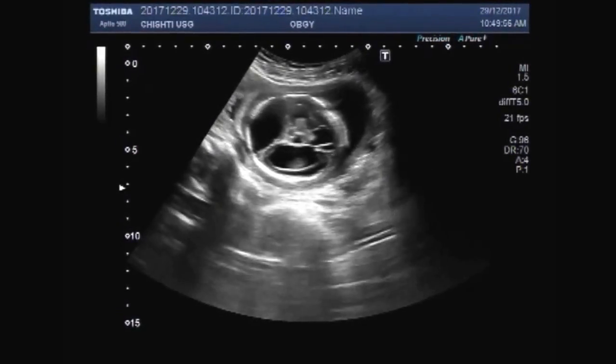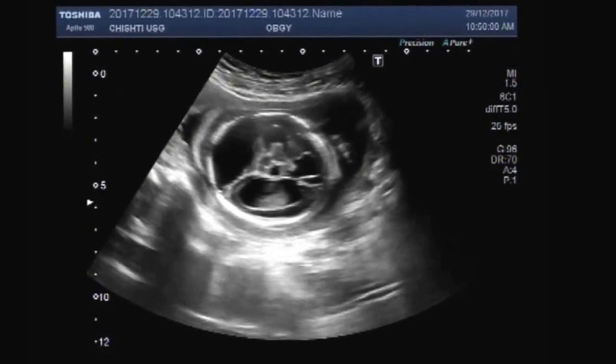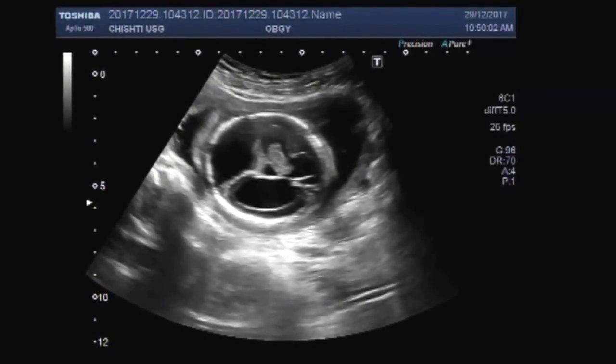You can see the brain ventricles are dilated — both the lateral and third ventricles are dilated, having plenty of fluid inside them. These are the dilated ventricles.